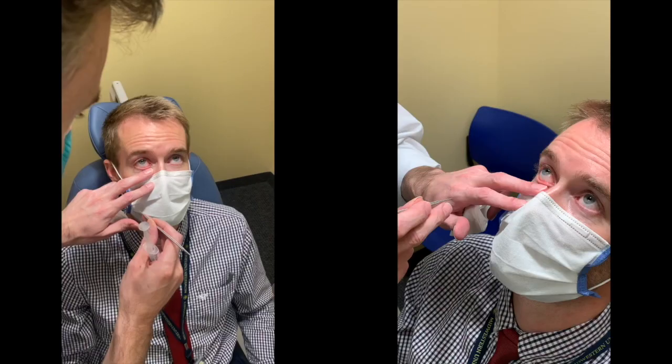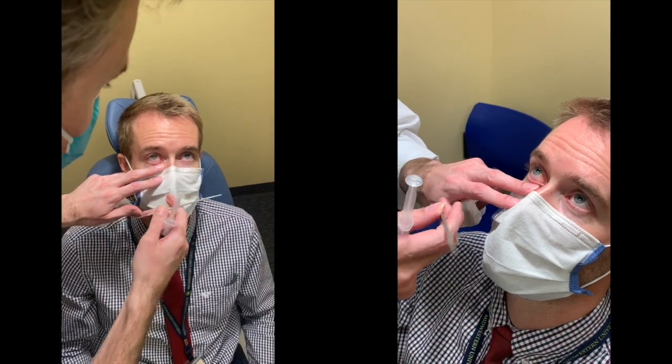Video regarding punctal dilation and irrigation. We first start with the right eye, the right lower lid. The probing is done standing up with the patient looking up.